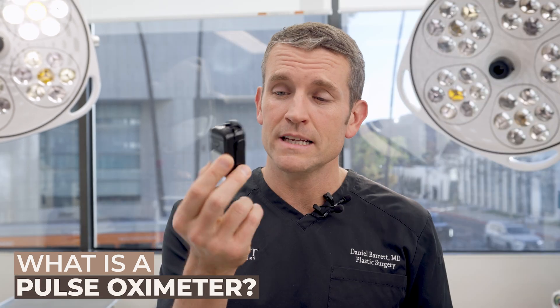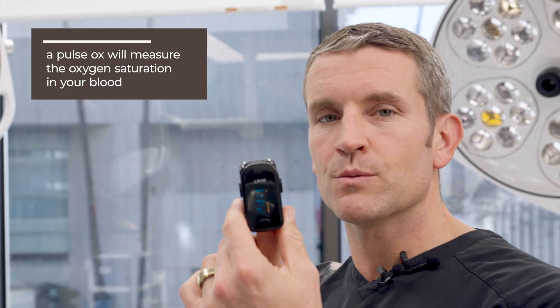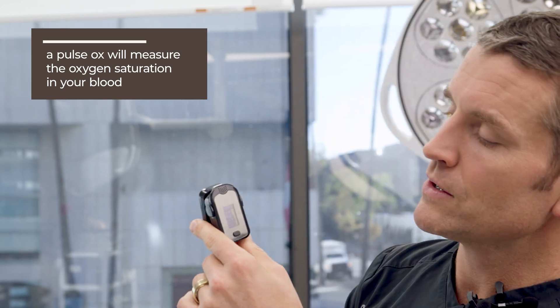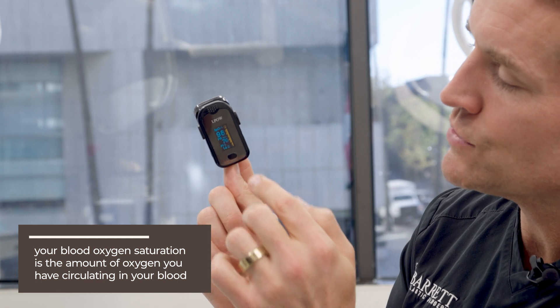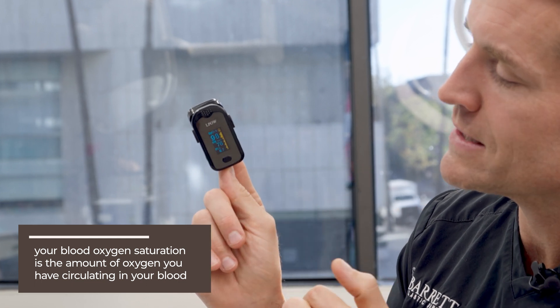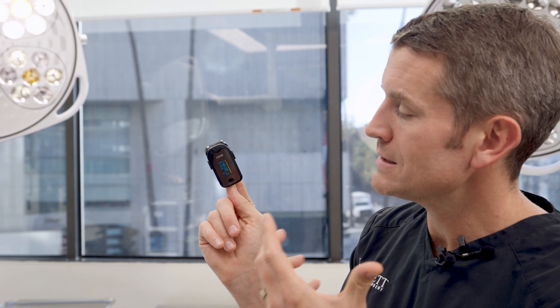This device could save your life one day. It is a portable pulse oximeter, and the good news is you can get this on Amazon — it's actually pretty cheap. It measures your oxygen saturation in your blood. As I'm talking here, you can see it's reading my pulse, which is fantastic, and my oxygen saturation is about 98 and my heart rate is about 76.